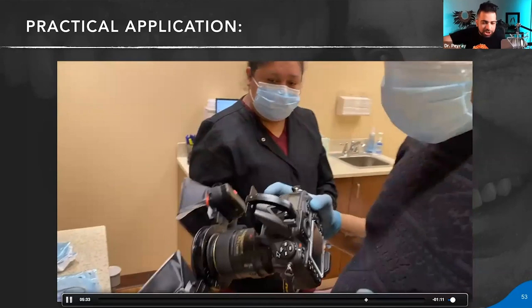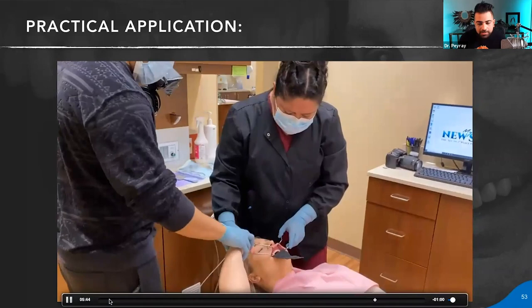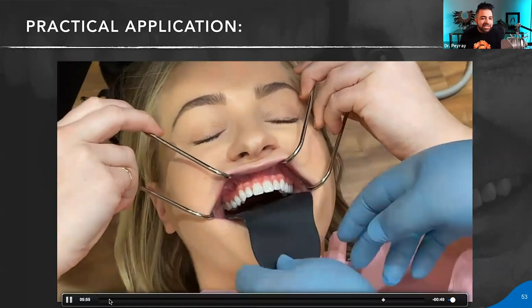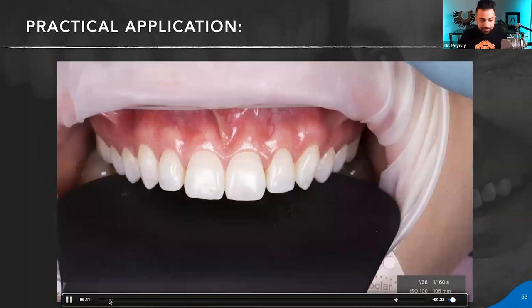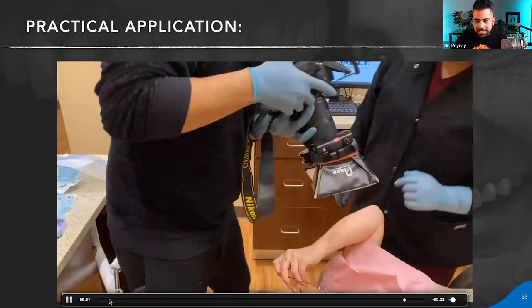And then sometimes you could also ask your patient to help you hold. So you bring their hand and then hold it, guide them through. And a contraster is pretty cool because you can mold it wherever, and that gives a nice view. What would I do in order to get the same shots? I'll just have the patient like that. Again, same style, everything the same. Left side.